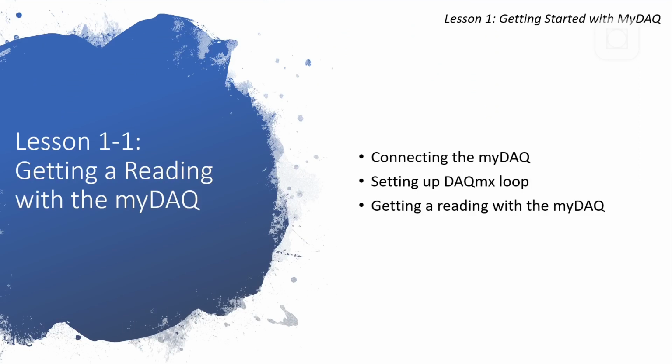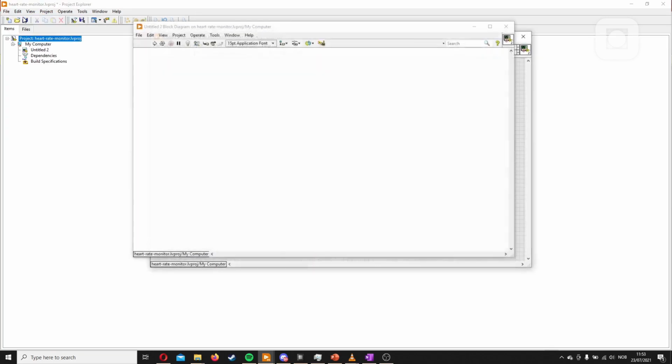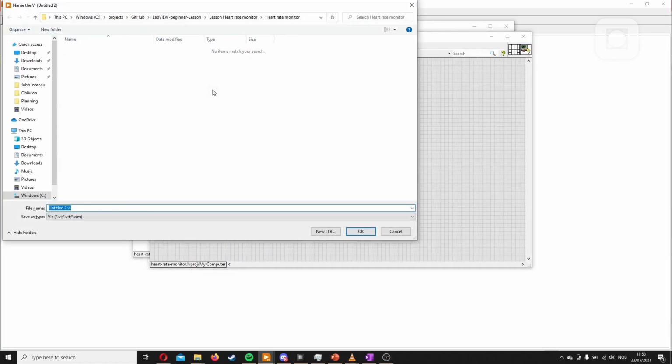In this lesson we will connect up the MyDAQ, we will set up the DAQ-MX loop and then get a reading with the MyDAQ. At the end of this lesson we should have a continuous reading from the MyDAQ. We can start by creating a new VI. We'll call it after lessons.